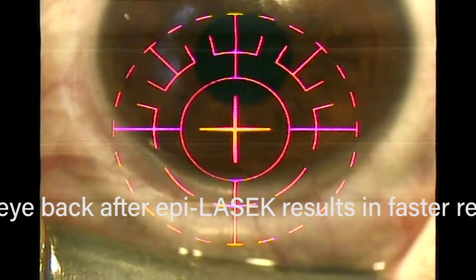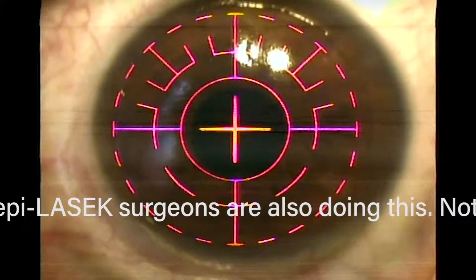One of the patient's friends watching — a companion — asked, 'Is there any way you could go into the cornea by mistake?' The answer is no, because both the spatula and the separator are blunt. You can't even go into the cornea if you wanted to. That's why it's safer than LASIK.